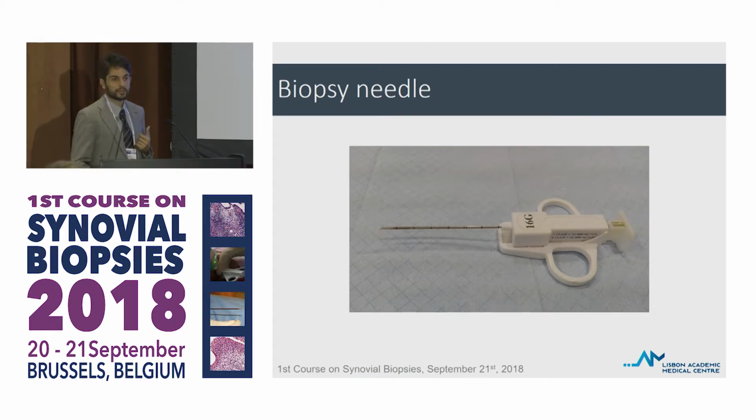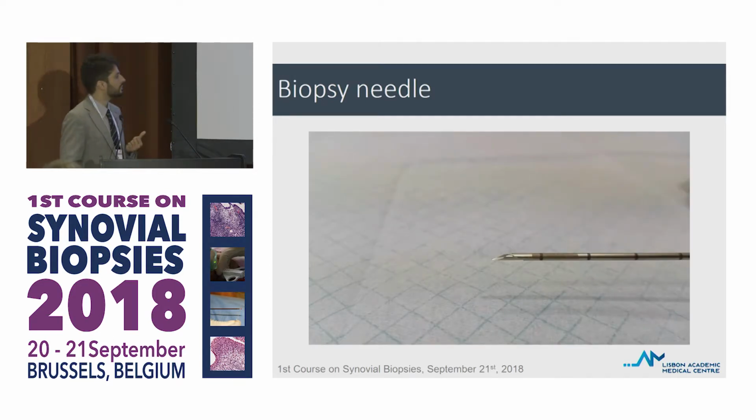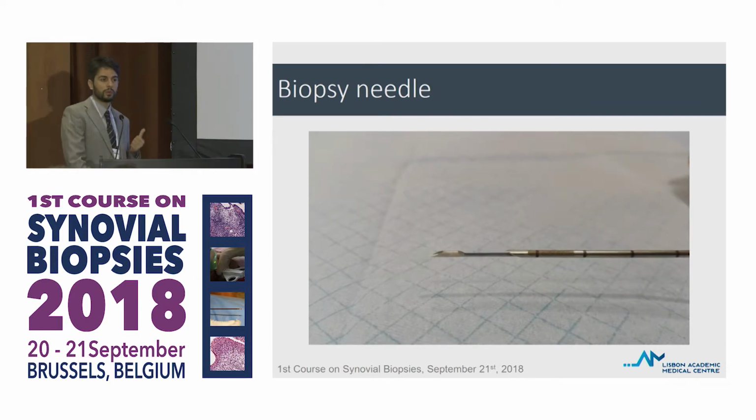So this is our needle, the one we use. It's not very different from the others. It's just another brand, okay? So it works the same way. We have the 16G. As you may see, with one click, the throw opens 1 centimeter. With 2 clicks, it opens 2. We mostly use the 1. Opening the 2, as someone said before, you bend it a little bit, and then you probably will have to change the needle in the middle of the procedure, which is not nice, because they are not that cheap, okay? Just put the video. It's just to illustrate what you have seen before in your hands, but this is how it works. And one important thing, to get good material, when you open the throw inside the joint, you always have to push it against the synovium before you shoot the throw to harvest the material.